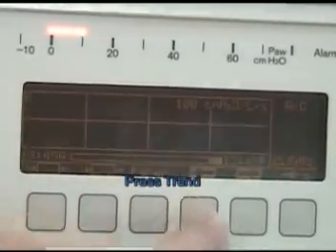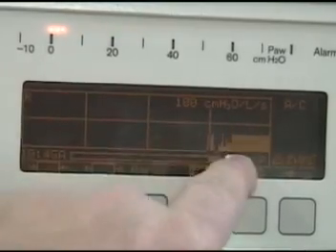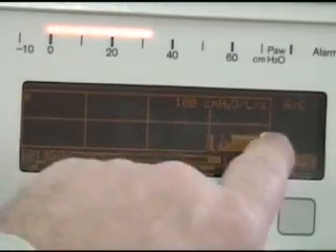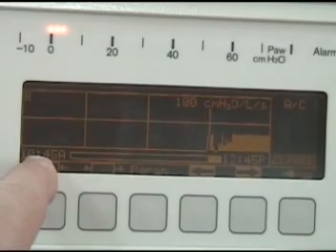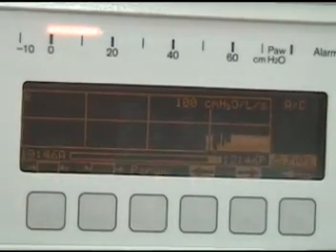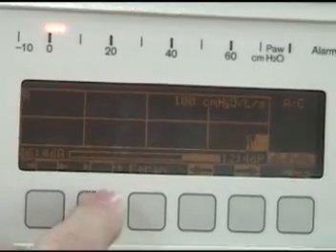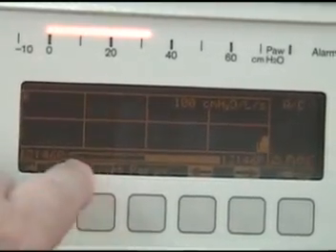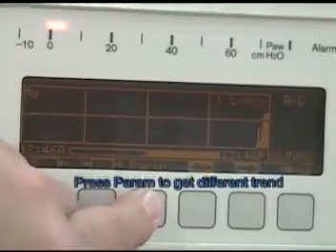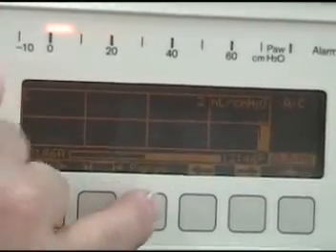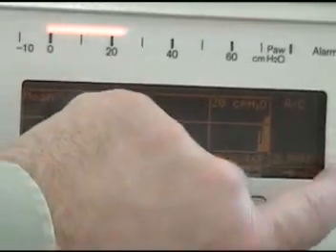Trend here will give you information over a period of time. This is the peak pressure and what was happening to the infant over this period of time, starting here from 10:45 to 12:45 — a two-hour time frame. You can change that time frame by adjusting this. We can change the parameters that we're looking at: mean airway, minute volume, FiO2, compliance, resistance, and that information there.